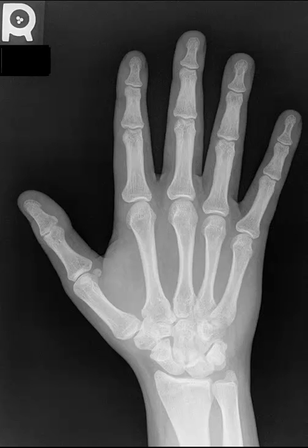Welcome back. This is Dr. Jamie Motley, and I will be covering a standard radiographic examination of the hand. Standard projections of the hand include PA hand, medial oblique hand, and lateral hand. There are multiple accessory projections that we will not discuss in this tutorial. However, they are very useful for evaluating anatomy that is not well seen or even pathology that needs further evaluation.